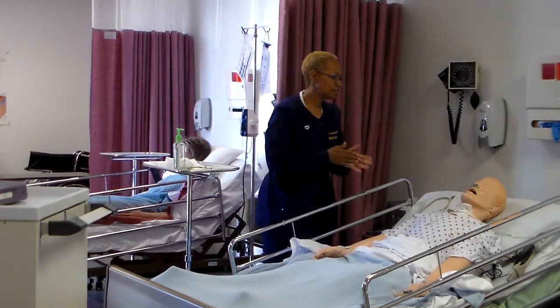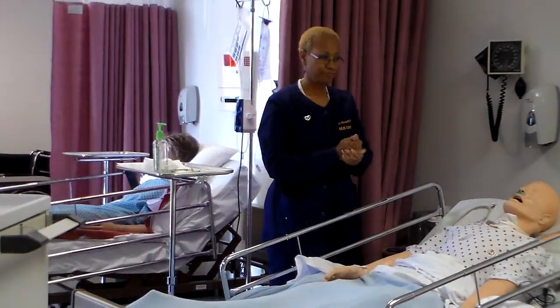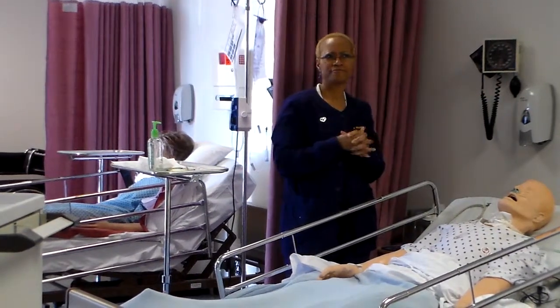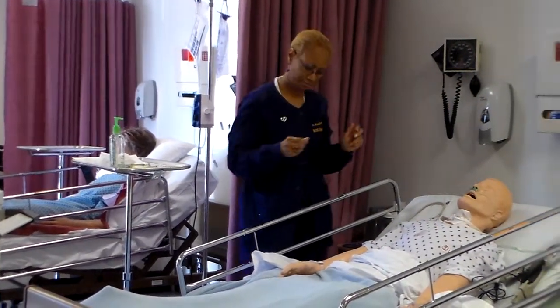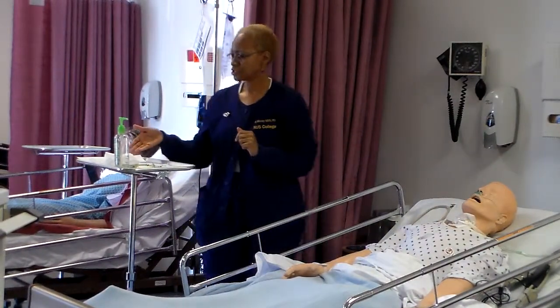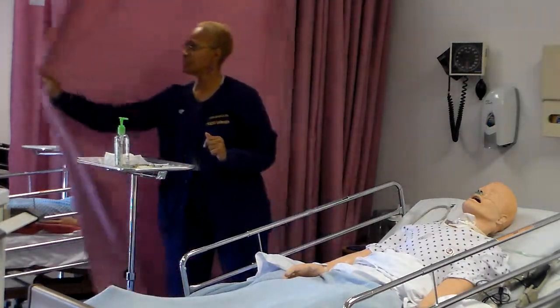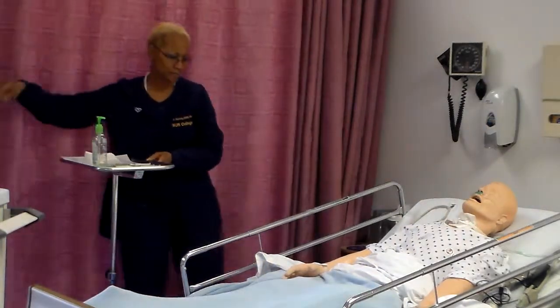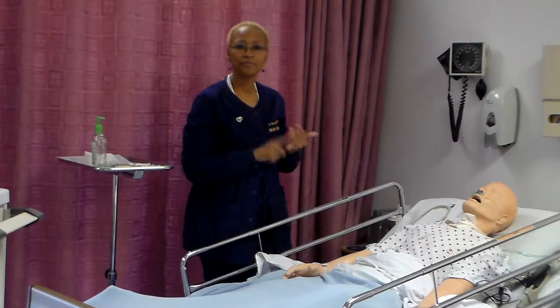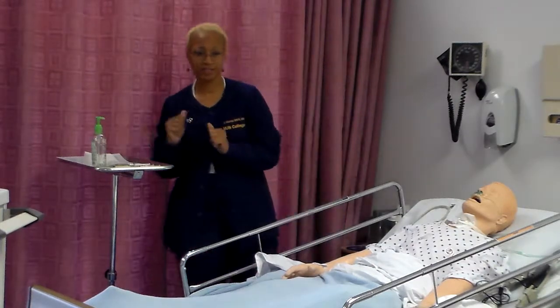Can you please state your full name and date of birth? It says his name is Jeffrey Johnson, and his date of birth is September 5th, 1930. And then I check that with his ID band. It is correct. I'm going to pull my curtain. I also look for his allergies. Remember, I said that he was allergic to penicillin and codeine. All right, so we're good, and I'm not giving penicillin or codeine.